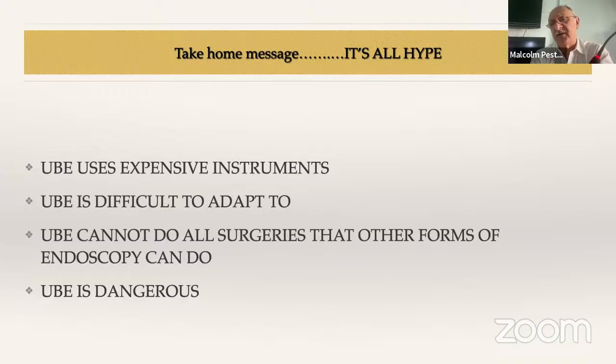I do anterior cervical endoscopies. It's very difficult, sir. You, being Dr. Malcolm, can have everything, but for an ordinary guy, you're talking about crores of rupees if you include everything together. That is where I'm trying to tell you that UBE is something that can be. If you talk from a delegate's point of view, for a delegate from a small town, he's going to spend 15 lakhs buying a stenoscope and then another transforaminal scope or a normal interlaminar scope for another 6-7 lakhs, and then the setup. My entire UBE setup is done in 10 lakhs here.